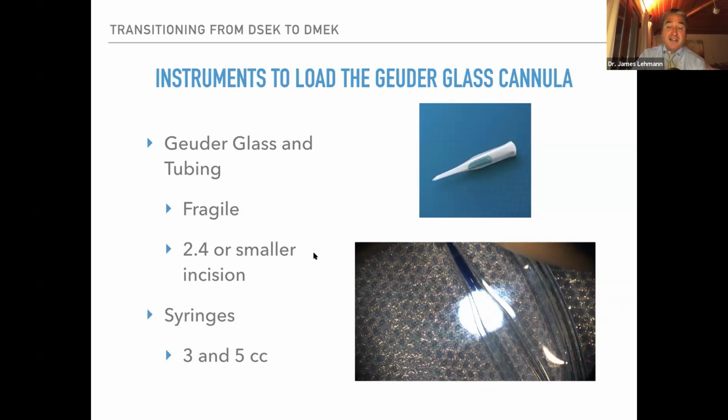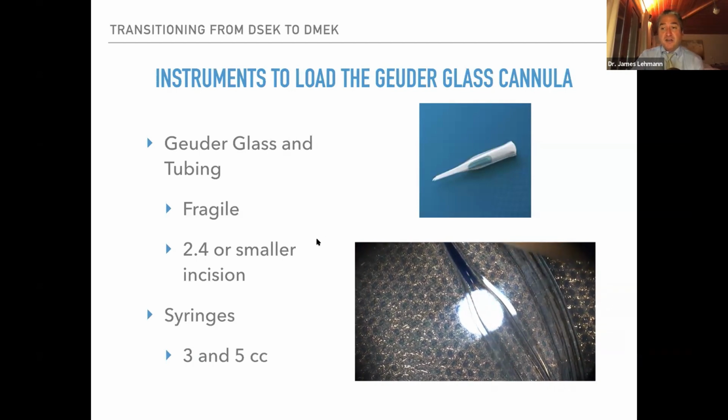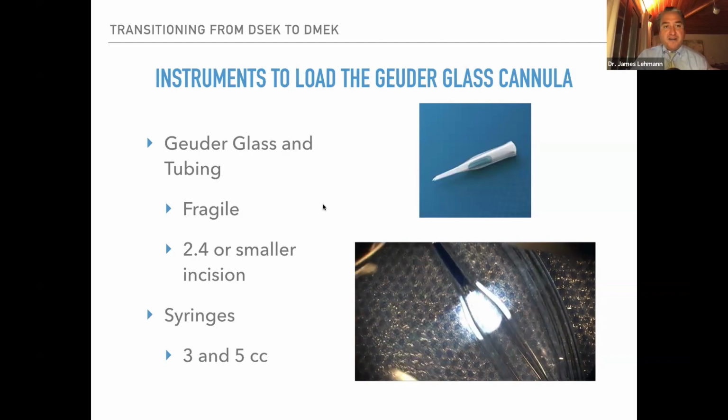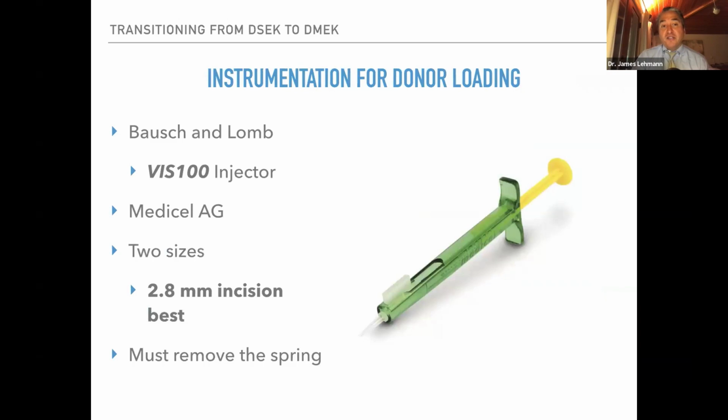Now it's glass, and I guess theoretically you could just re-sterilize it. So different countries have different rules about that, but unfortunately in the US we're kind of hand-tied in this respect. So the other thing you can use is an IOL injector. This is the one that I recommend by Medicel AG.